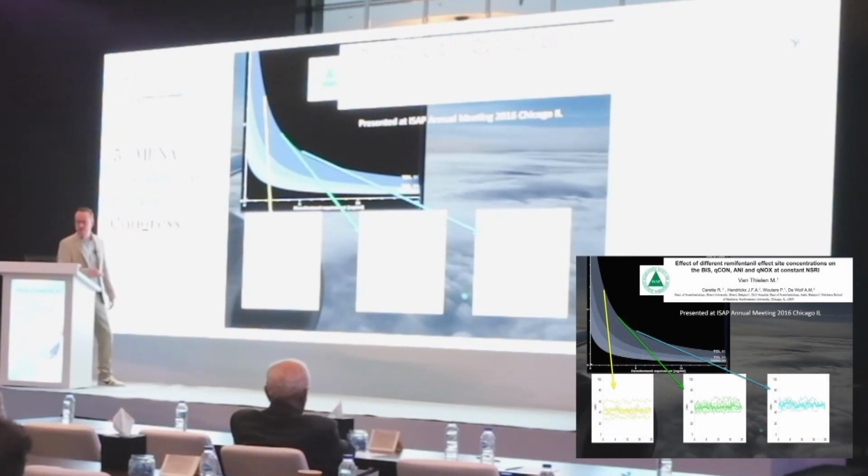How much can I reduce my dose of inhaled anesthetic? This is a study we did in our hospital, where we were literally surfing down the isobole. We started with 1.3 MAC, and we went all the way down to 0.6 MAC. We adjusted the opioid concentration accordingly to stay above the isobole. Over here we have almost around 1 nanogram per milliliter remifentanil, and here we have 5 nanograms per milliliter remifentanil effect site concentration.